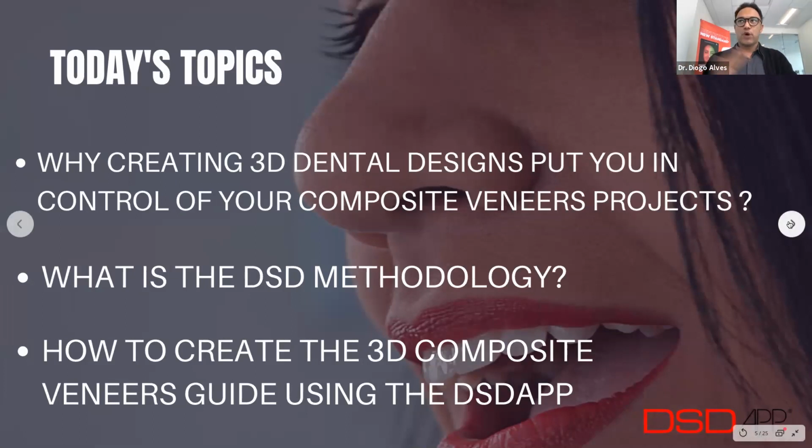The way that I structured this webinar today was in a way that I think you guys will understand. Like, how is it to become a digital dentist from the beginning to the end when you deliver that to your patient?